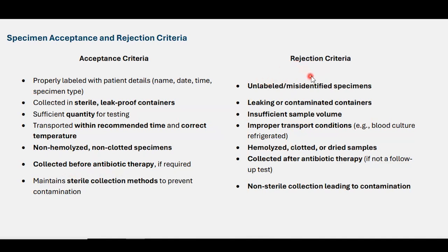Rejection criteria: unlabeled or misidentified specimens must be rejected, as they create misconceptions. Leaking or contaminated containers are a source of infection to others and lab personnel. Insufficient sample volume, improper transport conditions (e.g., blood culture refrigerated), hemolyzed, clotted, or dried samples are all grounds for rejection. Samples collected after antibiotic therapy (if not a follow-up test) give wrong results, as does non-sterile collection leading to contamination.